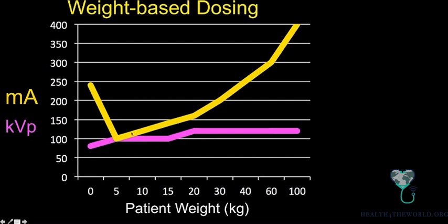We have a scanner that will reduce the dose if it can, but we set an upper ceiling: do not exceed this milliamp. These are numbers that we use based on phantoms that we've done in our own tests. You might have a slightly different setup at your institution, but at least have this set up for kids so that they're not always getting the highest maximum dose meant for overweight adults.